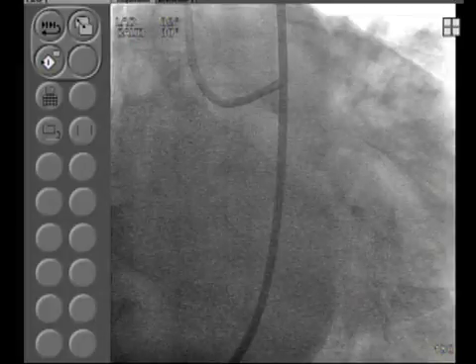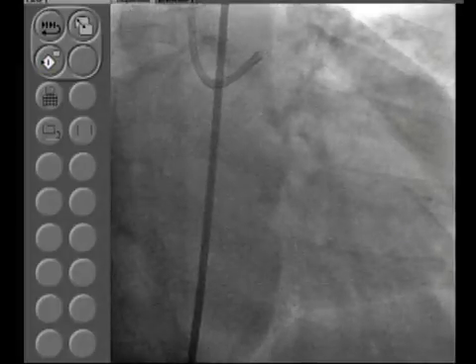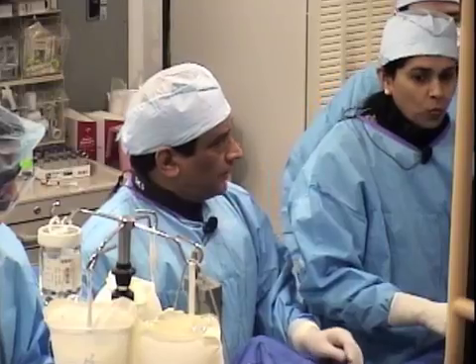Clearly it's a part of the heart technology, then of course taken up by Boston Scientific. Wire with the Rotawire? Yeah. First the IVUS, right? Or you want to do the IVUS on the Rota? Yeah, we can do that.